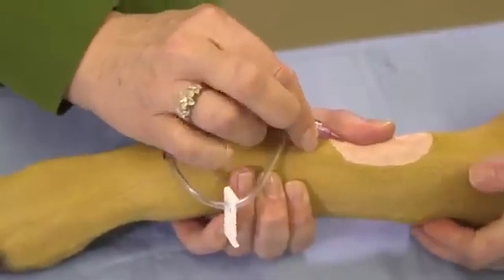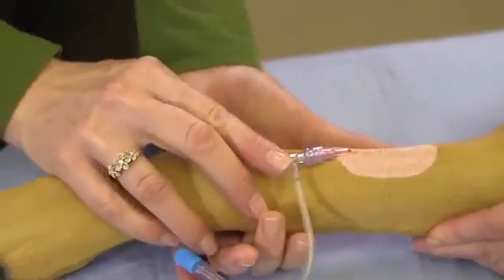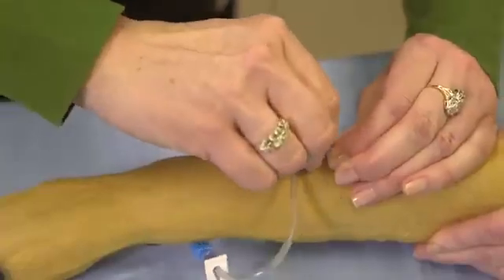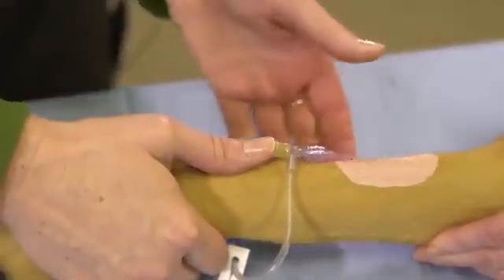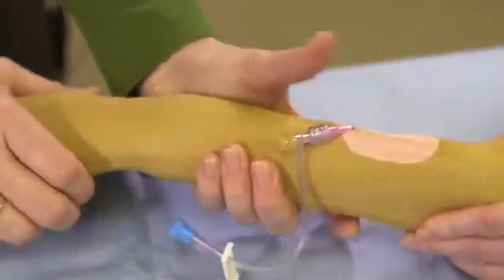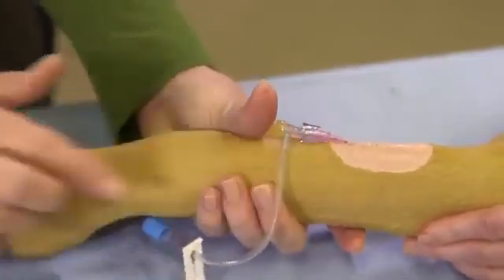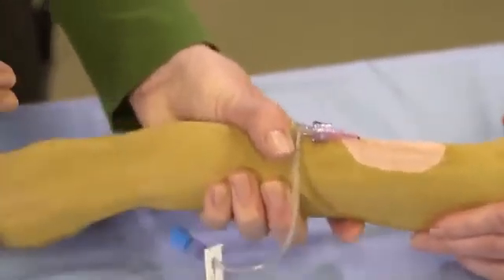Now, once it's kind of securely on and you've got good control of the leg, you can let go, grab your catheter end, and securely tighten. Now, you want to keep this stable, otherwise it may just fall out. So grab your leg, take your thumb, and push forward a little bit so that it can't slide back. We got good control here.